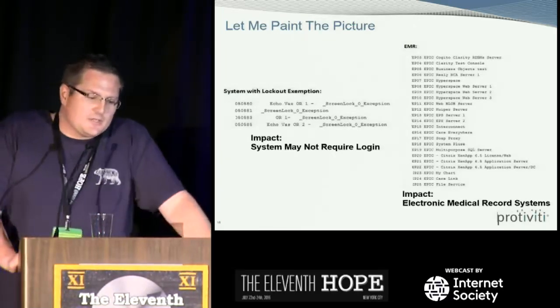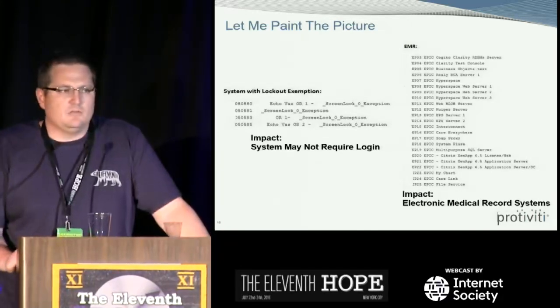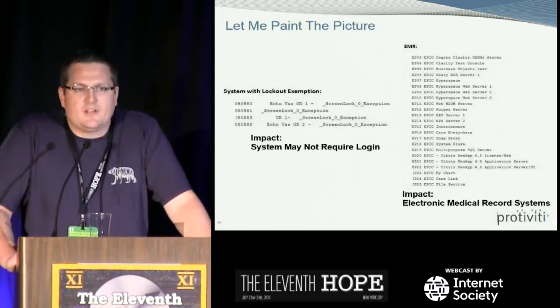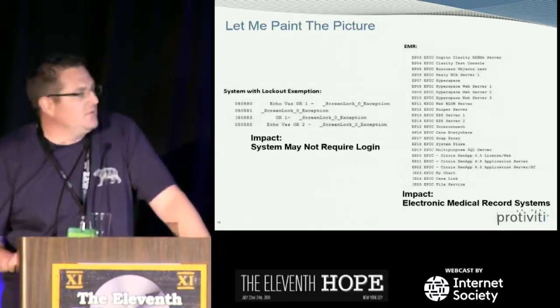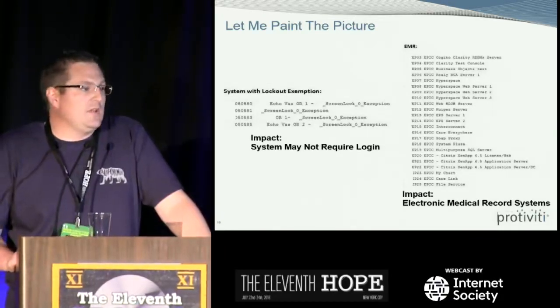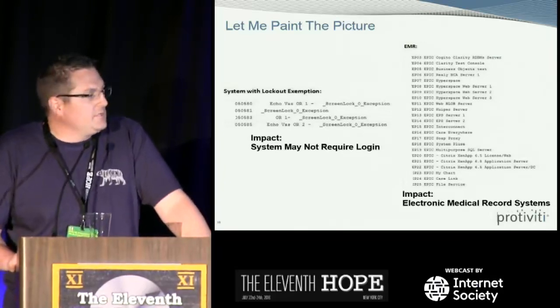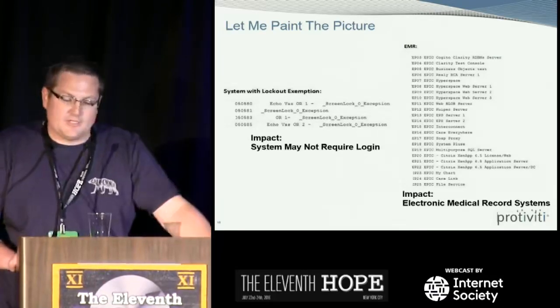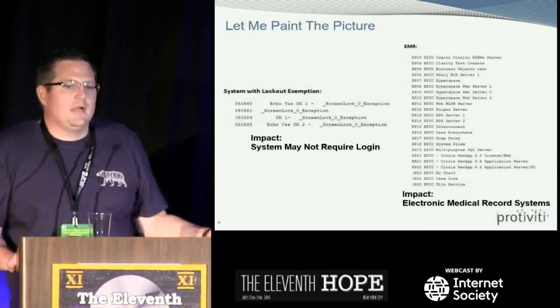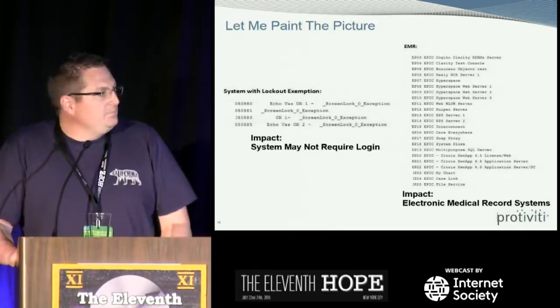system. Now, this healthcare organization happened to use Epic, which is a very large provider. This isn't an Epic issue, right? This just happened that they used Epic and they misconfigured their edge network with this vulnerability. But these are all of the Epic servers that hold all of that patient data, a treasure trove of information sitting out there. And if you're familiar with Epic, down on the bottom there's MyChart, My Health. That's the actual patient portal backend server that you use as a patient to connect into the environment.